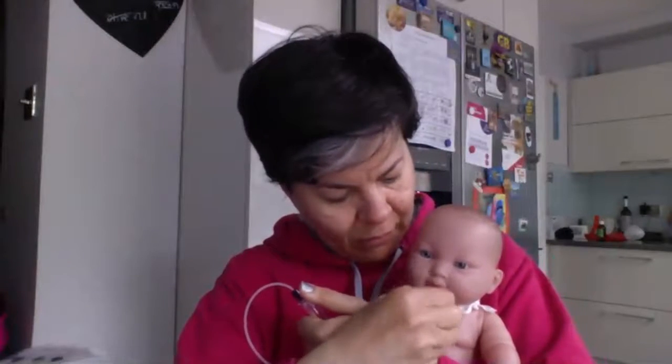Right, so imagine I press the button on the suction machine and it's going zzzz. What you would then do is take your catheter while the machine's pulling. You would stick the catheter in here, with your finger off of the catheter. Okay, don't ask me why, but she's got quite a sticky trachea. Anyway, you press down and we go. And you would pull out. Now, some people say swizzle, some people don't say swizzle. I swizzle. And then I use a catheter up to 3 times each time.